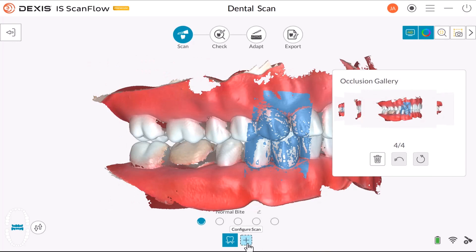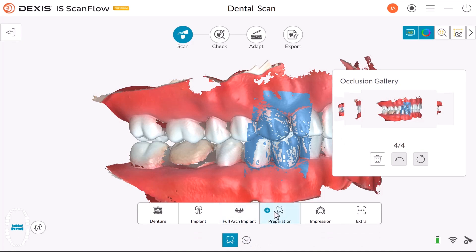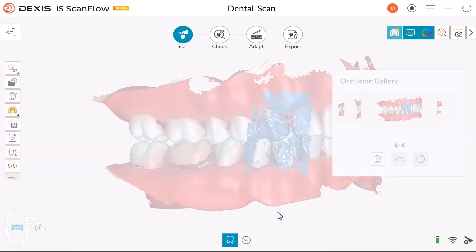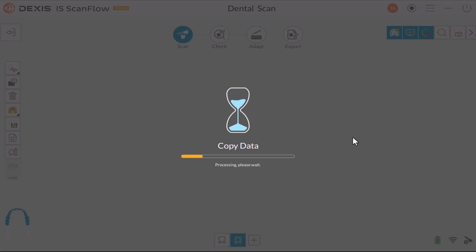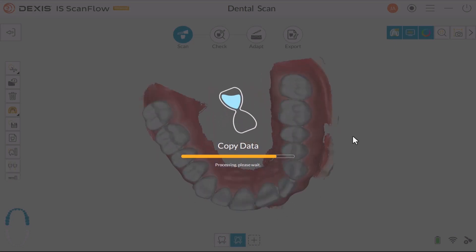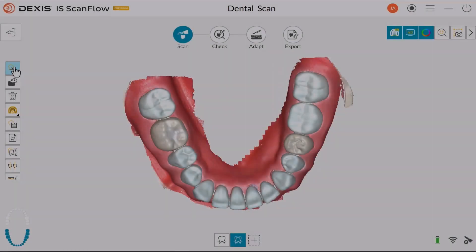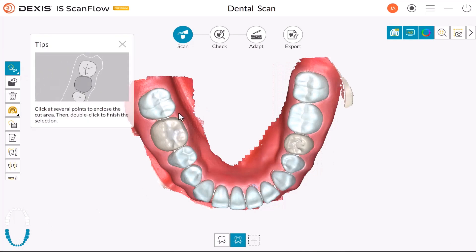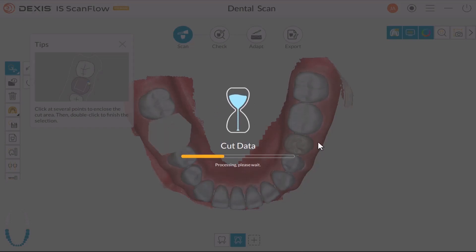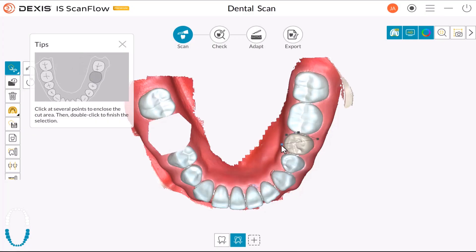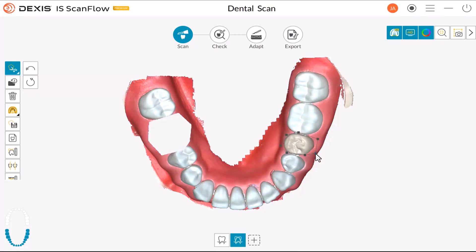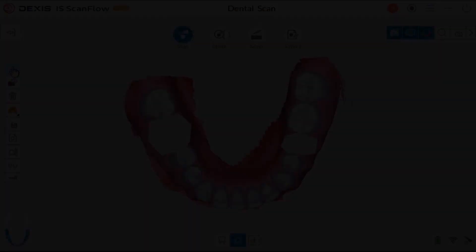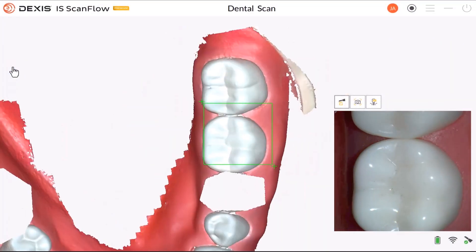Click the Plus Configure Scan button and select Preparation Scan. Cut out the area for the restoration. Then re-scan the Preparation Area.